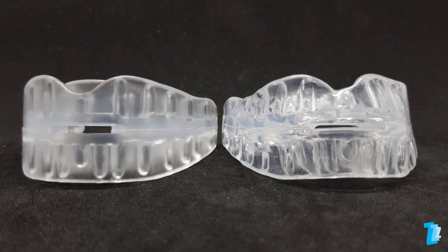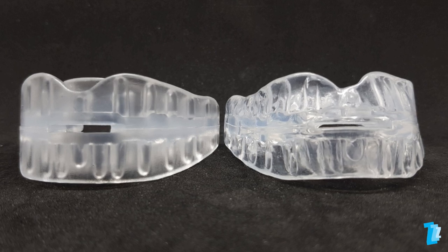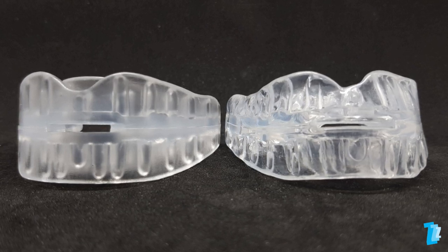Following the instructions, taking care at each stage of the process, and observing the correct timings will result in the successful fitting of the Somnugard 3.